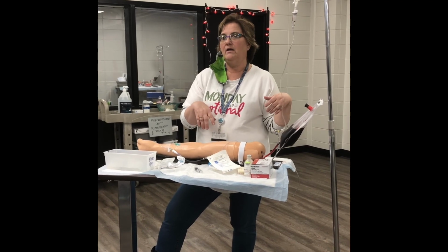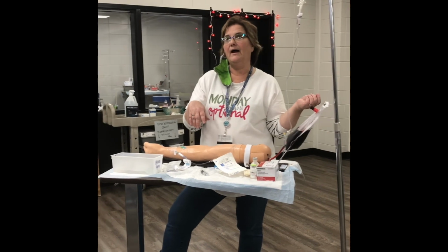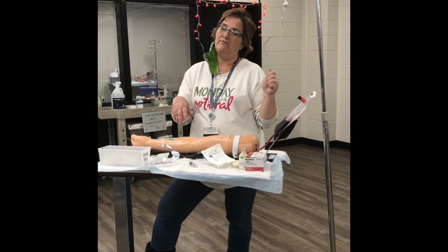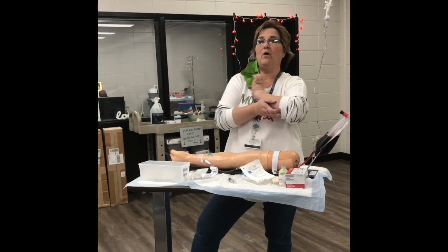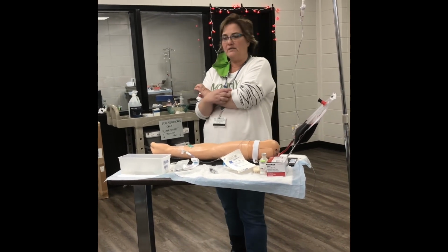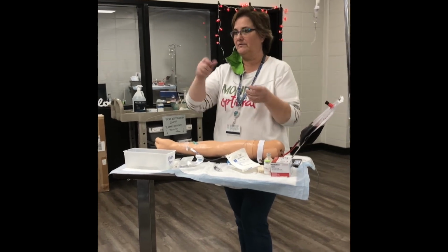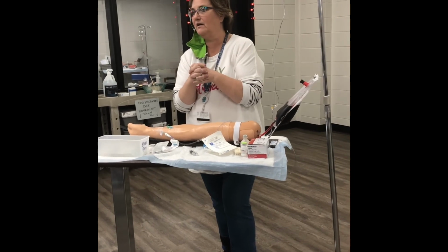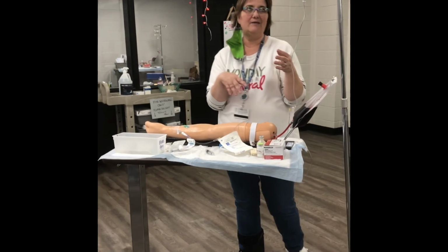Now, I wish you weren't taping me, but I'm going to say this anyway. I am 99.99999% sure you will never have to count drops. I had to do it twice, and that was because I was doing home hospice. Most hospitals won't let you, or they'll have the dial tubing, so you can just put the dial on the rate even if it's not on a pump. However, you do need to know how to do it just in case.